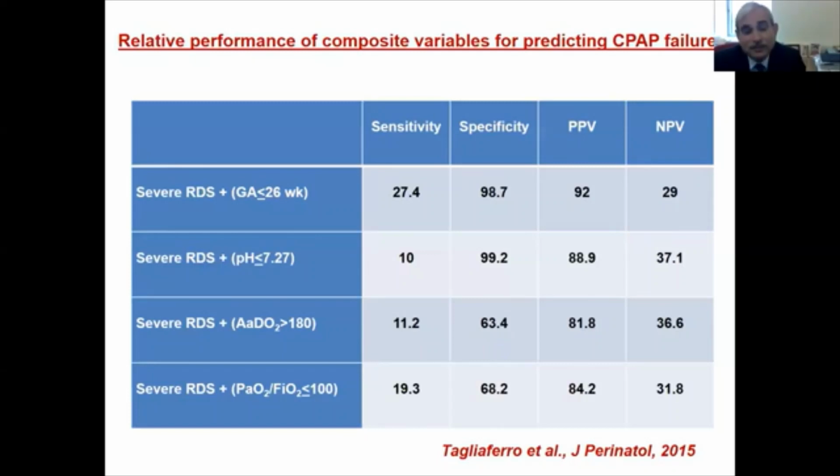We haven't done that, and I can tell you why. Number one, Columbia is unique in that we have a resuscitation area. We have a small NICU in the delivery room, so all our admissions, preterm, non-preterm, cardiac, we take care of all of them in that area, and it literally takes us 3 to 5 seconds to bring the baby into that area. It's very controlled, so the baby goes on CPAP within 5 minutes. We are set up to start nasal CPAP right away.